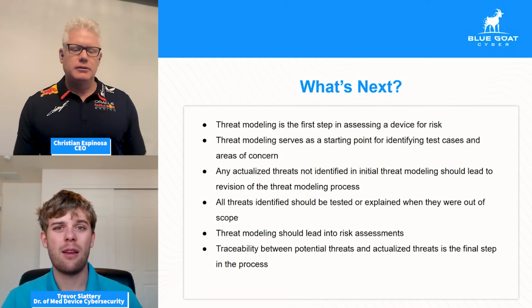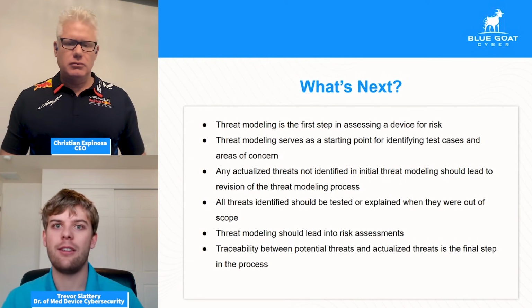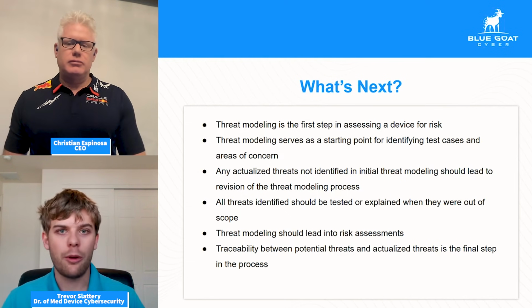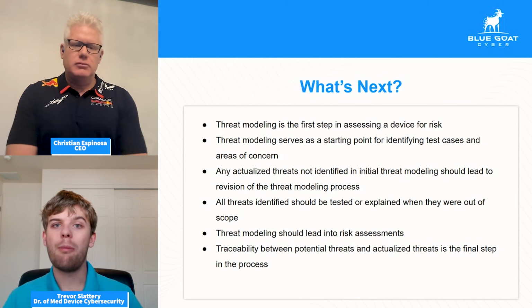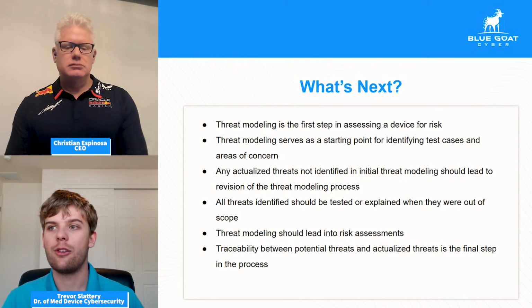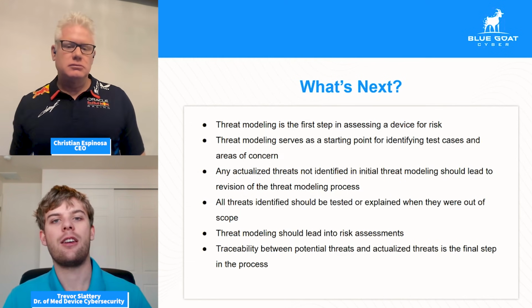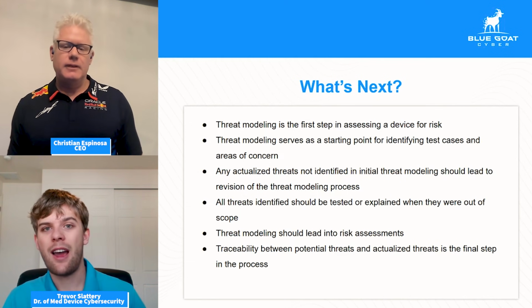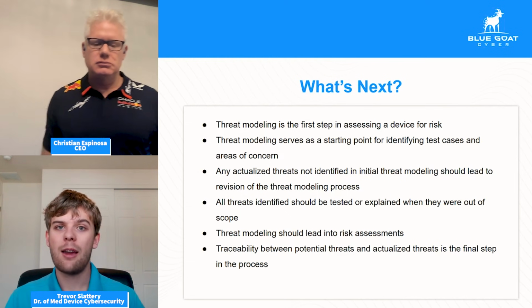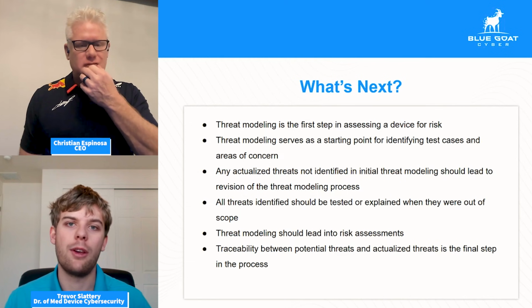Anytime we're seeing that we're missing something further right in the development cycle, we need to go back and start building security into the device. It's always going to be more of a time saver. It's always going to be more efficient and more effective to go back and design security in. It seems counterintuitive, and oftentimes manufacturers will try to just develop a product, get that minimum viable product out, and design security on later. This can be expensive, this can be time consuming, and it's not always going to be the best strategy. It's oftentimes going to save a lot of time and money to take a break, step back, try to revise the process, and then move through again correctly.